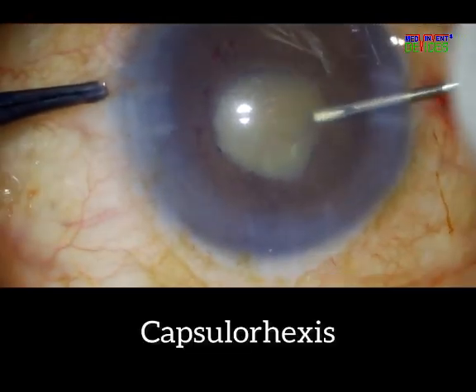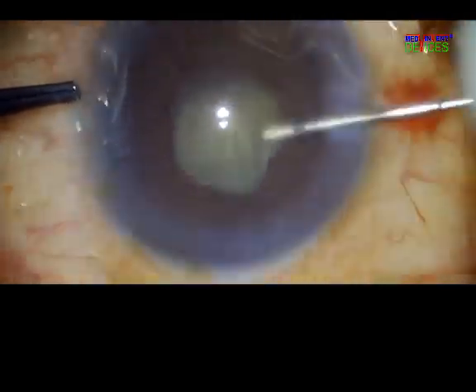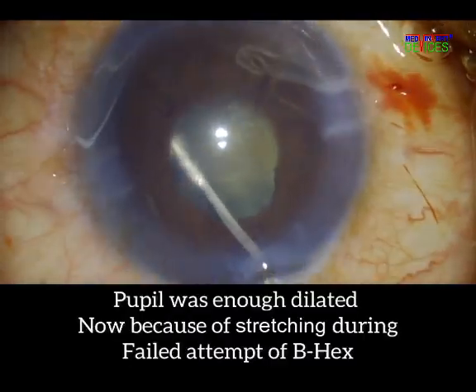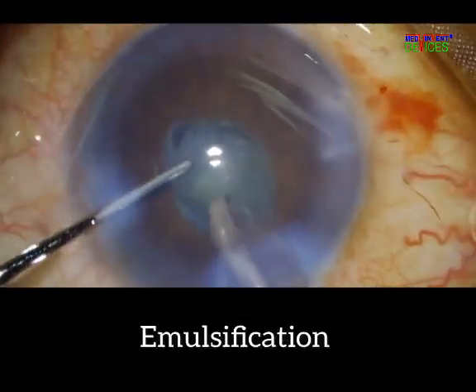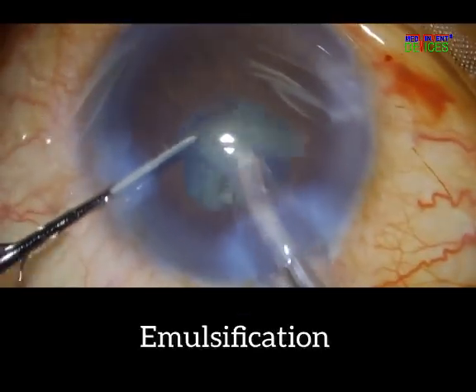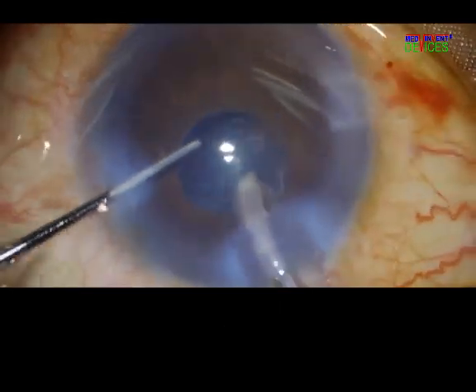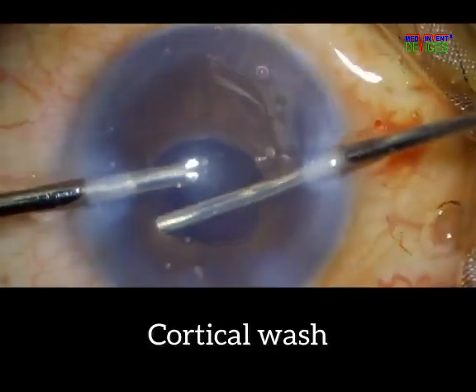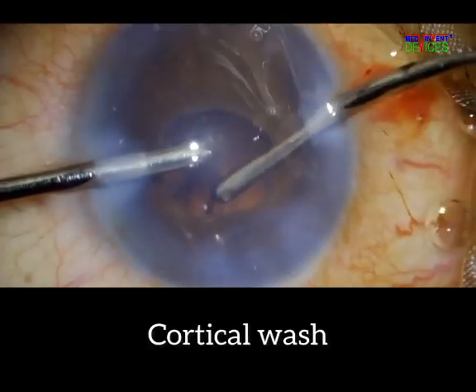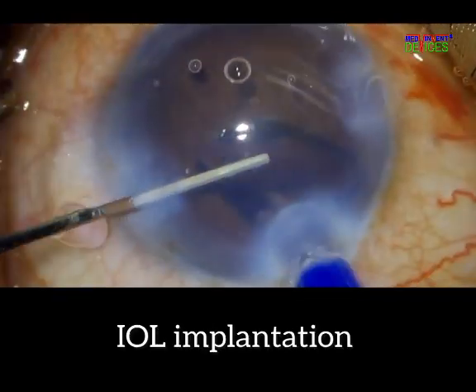As we can see, the surgeon is very skilled as he completes the capsulorhexis through a 4mm pupil without a pupil device, and then successfully pulls off the phacoemulsification and IOL implantation.